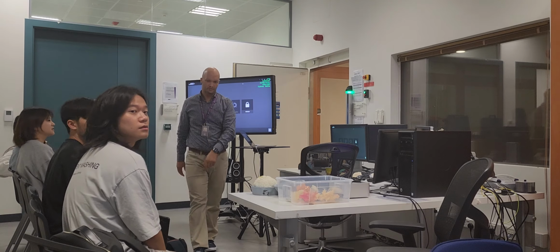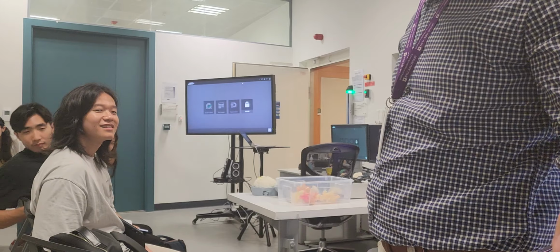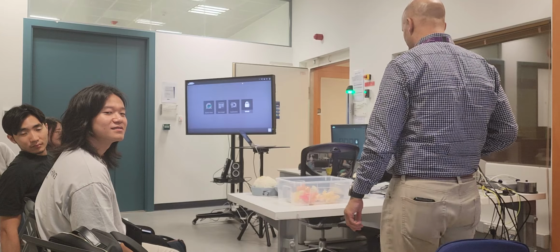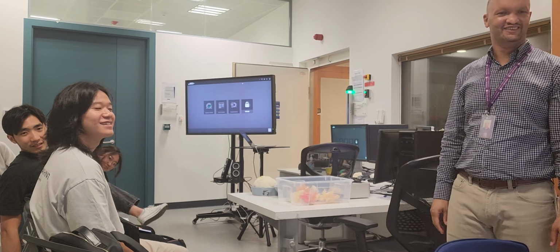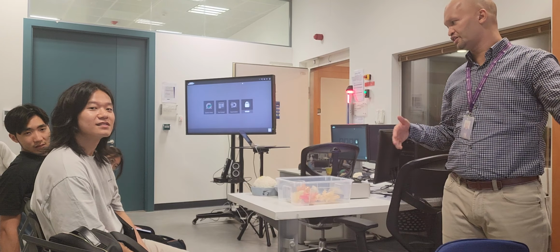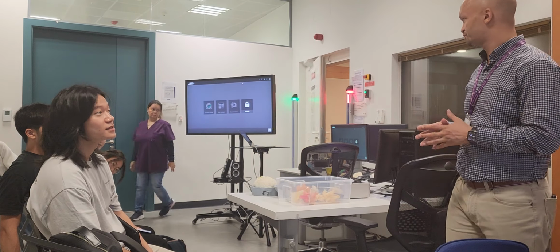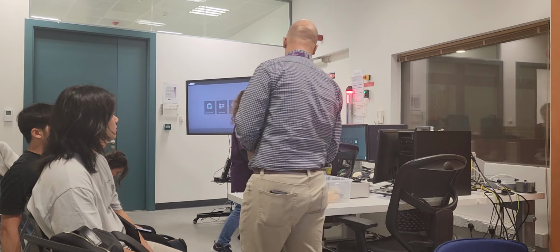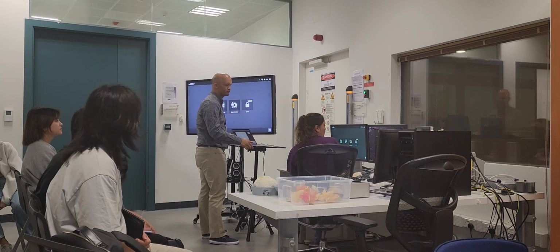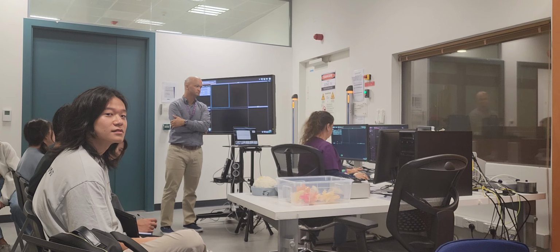You can see his eyes. We have an eye tracker inside the magnet, so if he sleeps, we wake him up. I'm just kidding. So we use MATLAB to control the stimulus presentation. In this case, all we're going to do is move and stop. So Haiti, we want to do a quick, actually, you can skip the anatomical scan, just localizer and the finger tap. You agree?